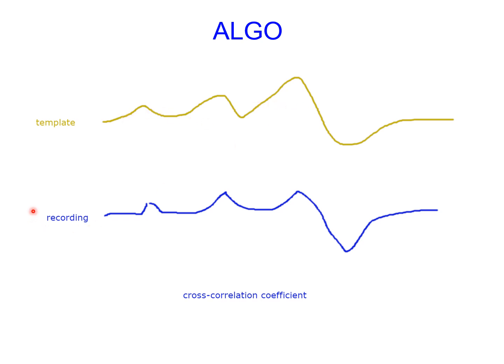Then here is the EEG, the averaged time waveform from a specific patient, say a newborn or an infant or child. We use the template from the same age group as your patient, and this is the average waveform you recorded from that specific patient.